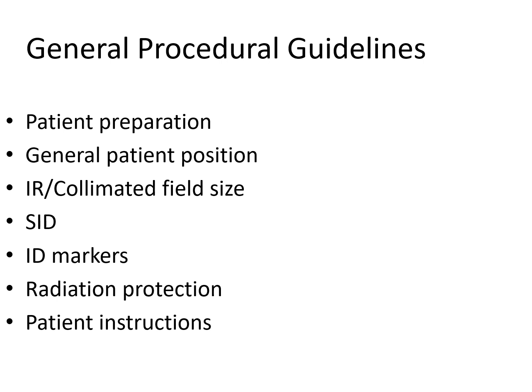Radiation protection, no reason not to shield anybody for this exam. The reproductive organs are well away from the anatomy of interest. It is no problem to apply a shield. The thyroid gland is radiosensitive, so if you have someone with thyroid issues who requests that you take precautions to reduce their dose to the thyroid gland, switch all your AP views to PA views, and you'll do just fine.